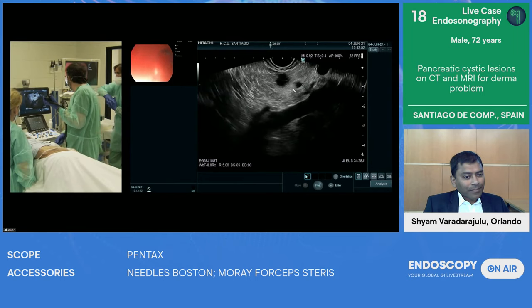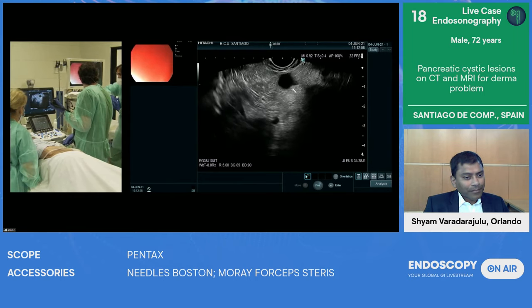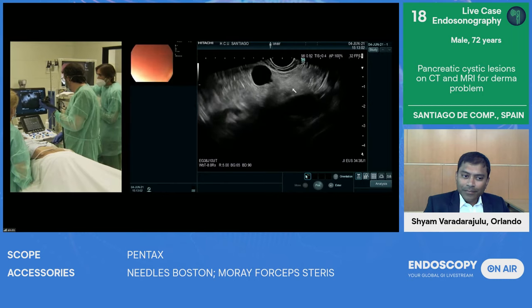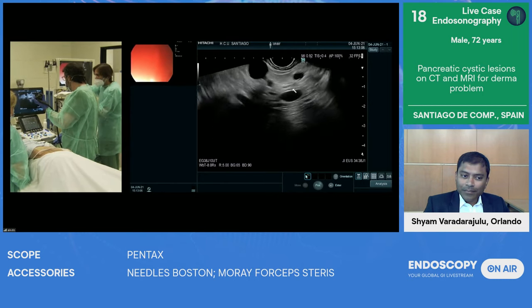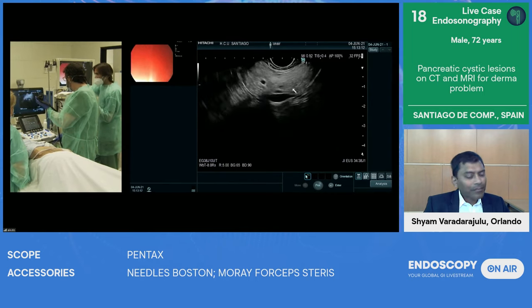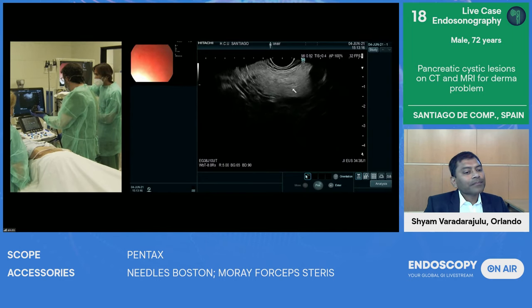On the other hand, Jose, you are next to me, what do you think about the pancreas? It seems to be a normal pancreatic parenchyma. No, not at all. It seems like a fat infiltration of the pancreas that is very commonly seen in patients of more than 70 years old. But not to be confused with chronic pancreatitis. It's not a chronic pancreatitis. It seems like a fat infiltration. And so this makes the exploration of the whole pancreas a little bit difficult.